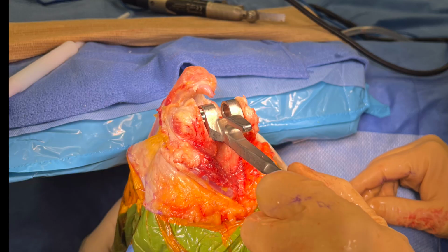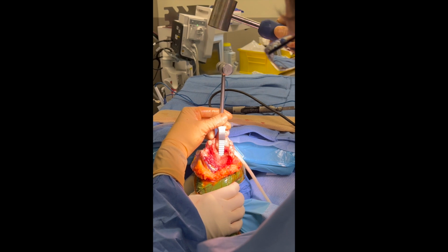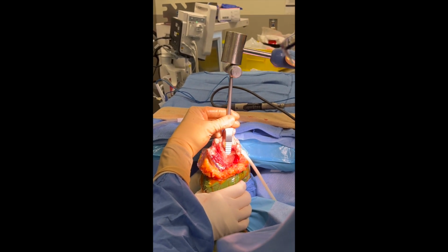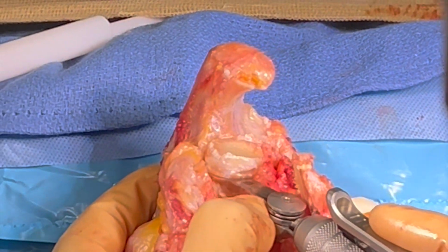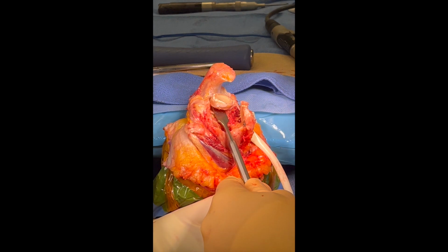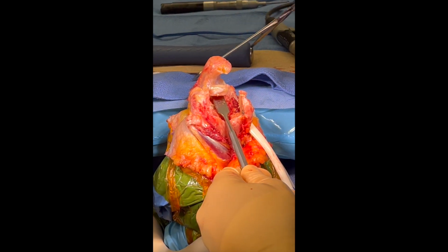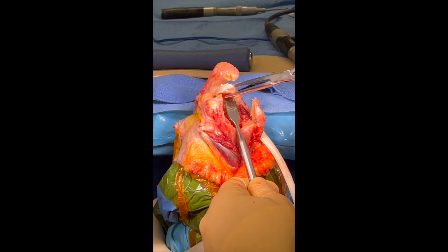The trial implant is next used to confirm accurate resection of the distal humerus. Excellent fit of the implant was noted. Next, broaching of the canal is performed, and then a resection of the radial head is performed, as there was significant radiocapitellar arthritis noted.